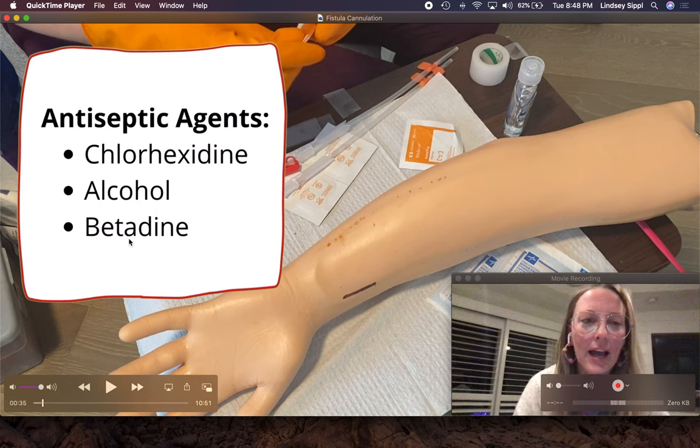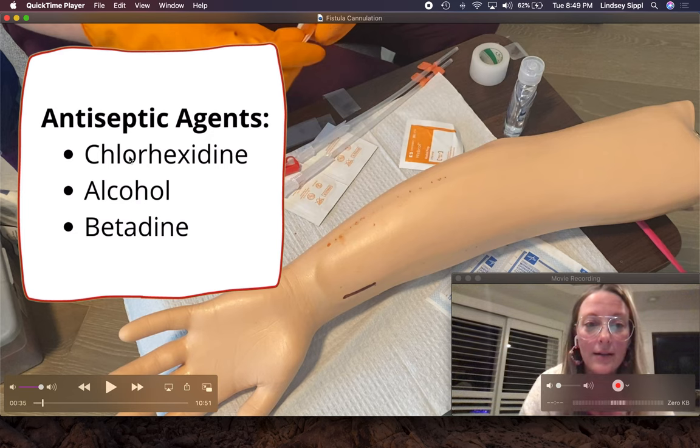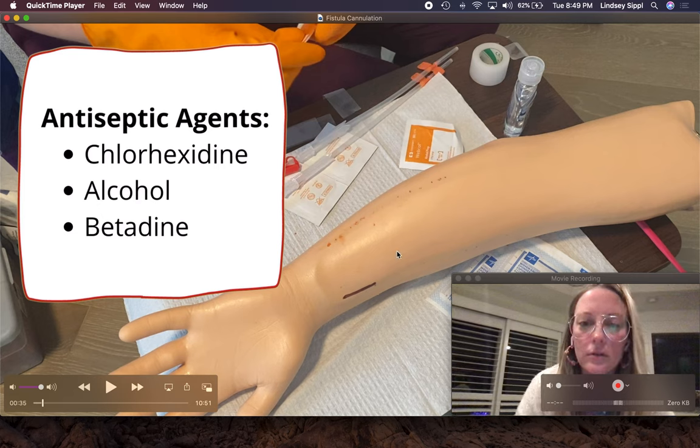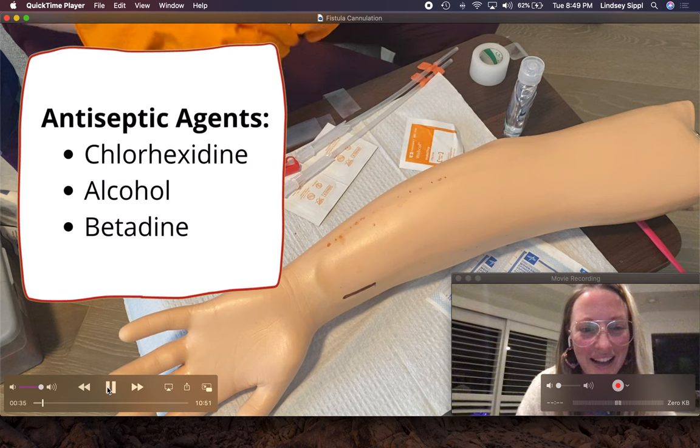Every facility might have different policies on antiseptic agents, how long they clean, and how long they dry. Chlorhexidine: our facility's policy is to scrub for 15 seconds and let dry for 30 seconds. This is very important because patients will get a rash if you do not let it dry and you tape over the wet skin. Alcohol is a 60-second scrub time and a quick dry. Betadine is for people with really sensitive skin; you do a circle application and let it dry for two to three minutes.